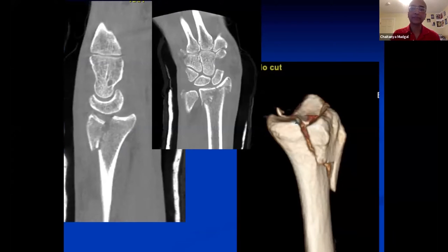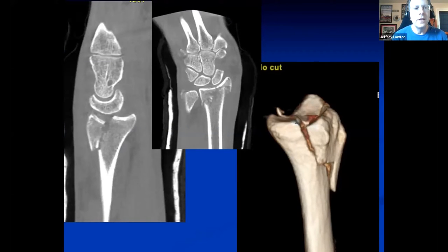Beautiful. On the CT, in addition to the radial styloid, there's a volar ulnar fragment and a dorsal ulnar fragment, and you can see the lunate on that lateral projection. The entire carpus is shifting with it — the extrinsic ligaments are attached to that piece, creating a radiocarpal subluxation.